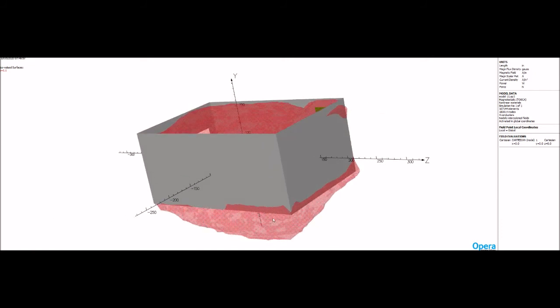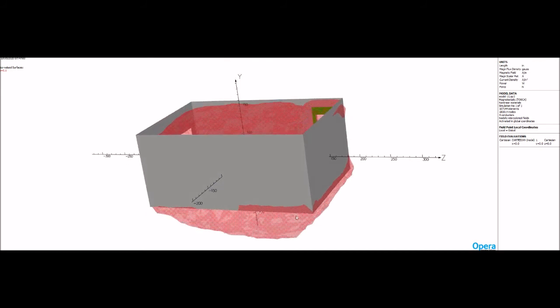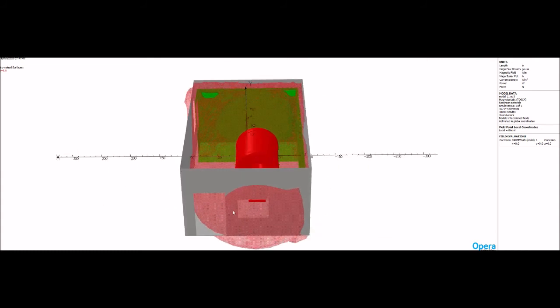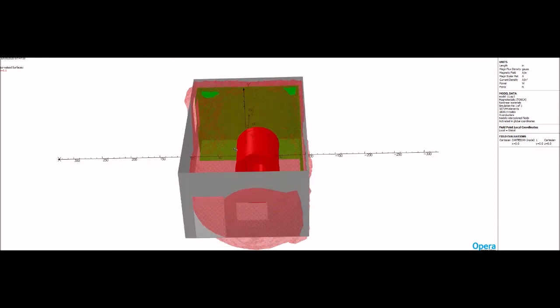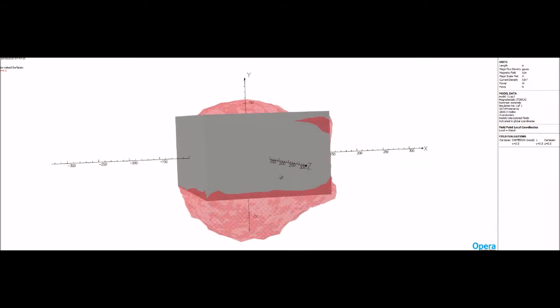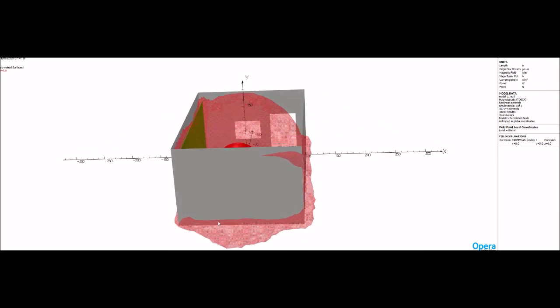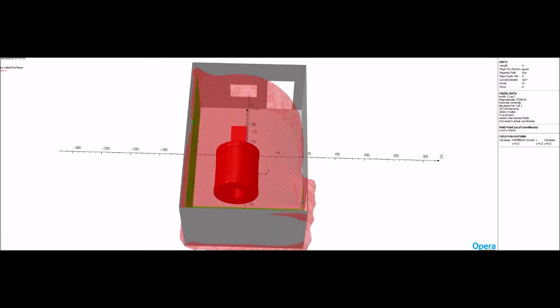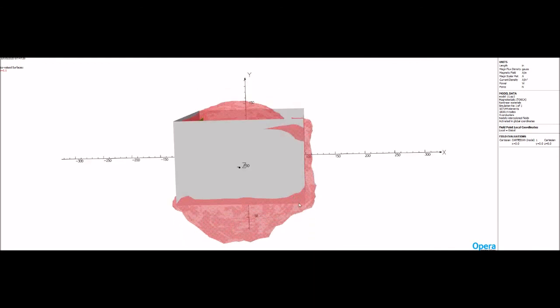So in order to eliminate all the 5 Gauss from coming out at those areas, which could be done, it would require a bunch of steel both on the floor and on the other wall, probably over here on the floor and on that wall as well, the right wall, and then more on the floor on the other side. Might even have to put some here on the ceiling if we wanted to completely eliminate every trace of 5 Gauss leaking out of the wall.